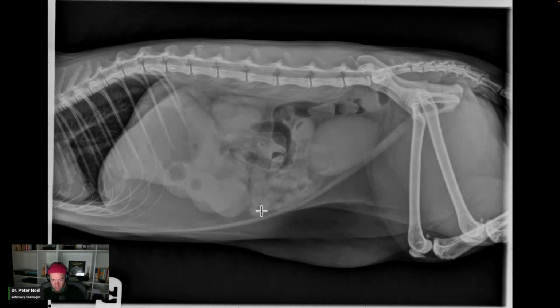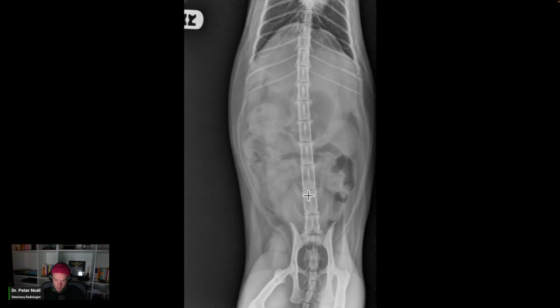Okay. So this small intestine looks pretty empty down here. But this thing, I didn't see this, but I saw this. Okay. So this thing, you go, well, could this be in the colon? Could this be the ascending colon? So then you go 7, 6, 5, 5, maybe 7, 6, 5.